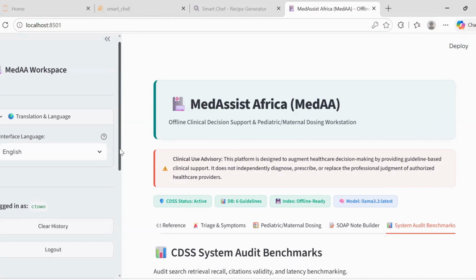And finally, it is good to note that this is built for African healthcare, and it works completely offline, supporting multiple languages and empowering healthcare professionals to reliably work offline and have access to guidance and resources.